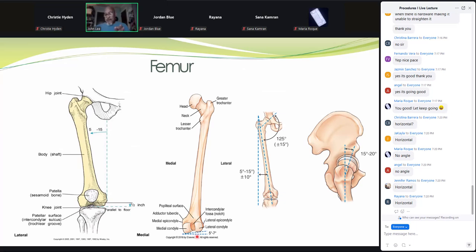So what you typically end up doing is adjusting, having them lean. I have the patient lean in their hip to cause the leg to go this way towards the IR, and that puts that 5 to 7 degree angle, and I shoot horizontal. Epicondyles are always level when I do that.